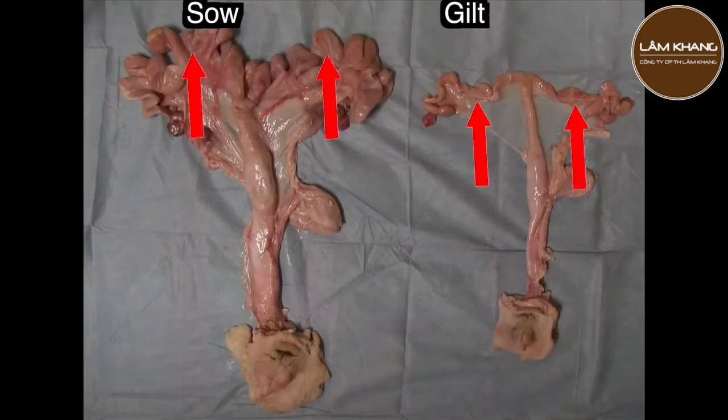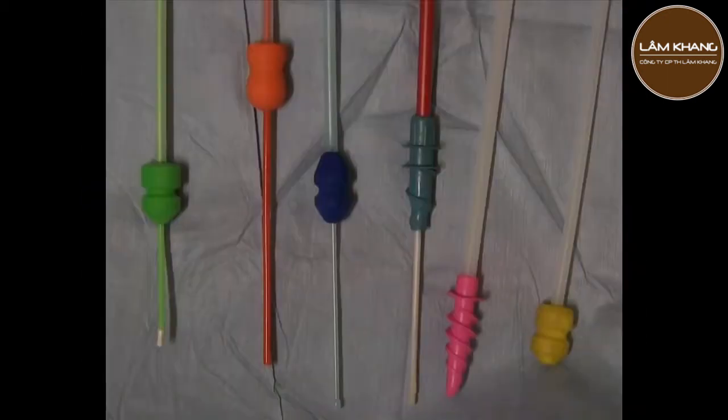The majority of the pig's uterus is comprised of uterine horns. The uterus houses the fetuses during gestation. At the far end of the uterine horns are the oviduct, where fertilization occurs, and the ovaries, which house the female's eggs. There are many traditional AI and PCAI catheters on the market.